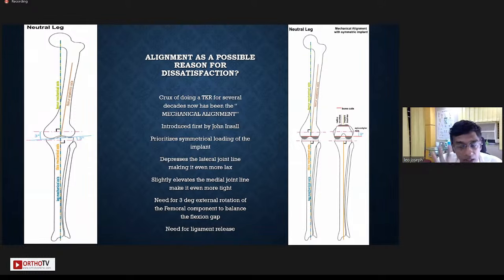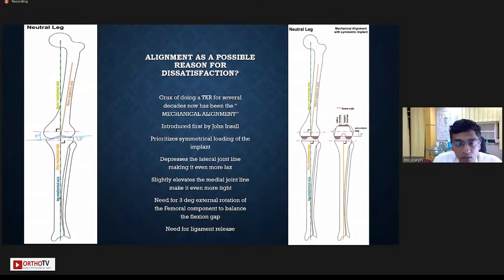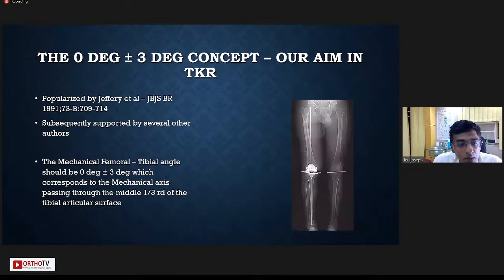So obviously, there is probably scope there for the reasons why patients may be unhappy with the results of the procedure. This is exactly what Insall said, and it was borne out by what Jeffery published in 1991, where he popularized the concept of 0 ± 3 degrees, whereby he said that the mechanical tibiofemoral angle should be such that it passes through the middle third of the proximal tibial plateau, which corresponds to an angle of 0 ± 3 degrees, which should be our aim. And that kind of became the Bible, or the philosophy, of doing total knee replacement.